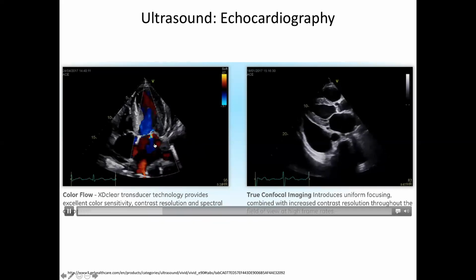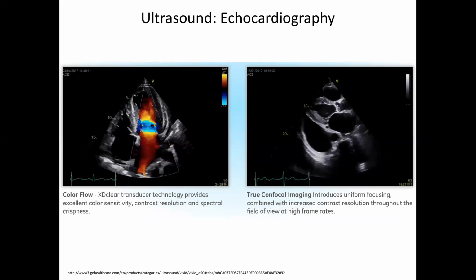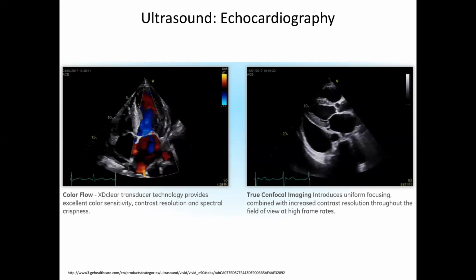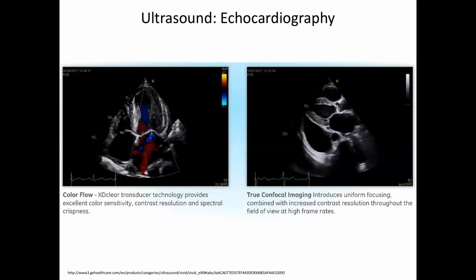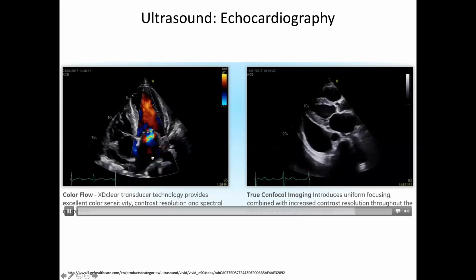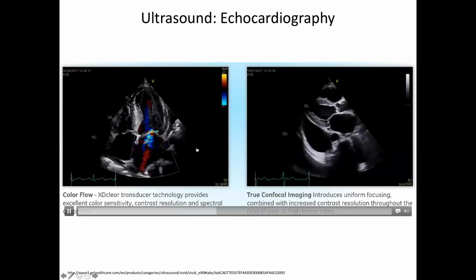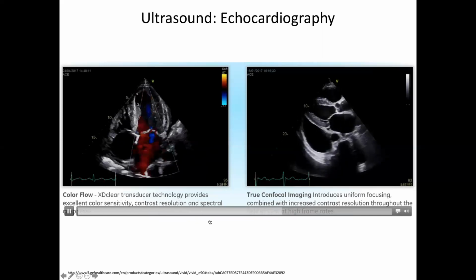And you can hear that sometimes with a stethoscope, right? When you listen to the patient's heart, you can hear a little whistle or something going off as that happens. But here you can image it and figure out exactly what the peak velocity is and things like that. So this is Doppler shift. It's a very powerful component of echocardiography for detecting things like this, right? As you can imagine, you have very high sensitivity for detecting that.